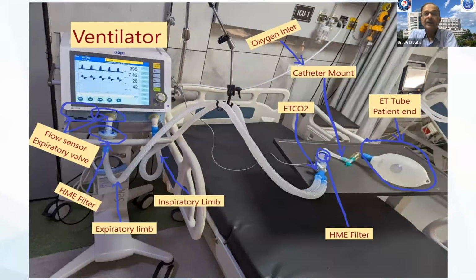You also have to watch out sometimes that the heat is transferred. You've got a wire or something which continues to heat the gas as it flows all the way up to the patient. Otherwise, you get a lot of water condensation in your circuit. So you need to take care of that. So you have to be also careful in how the water in the humidifiers is changed and how it is handled, because they have been known to be sources of infection, and you can carry infection into the patient. So you need to be careful when you handle those.